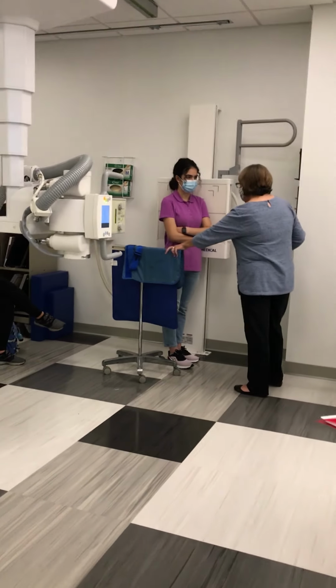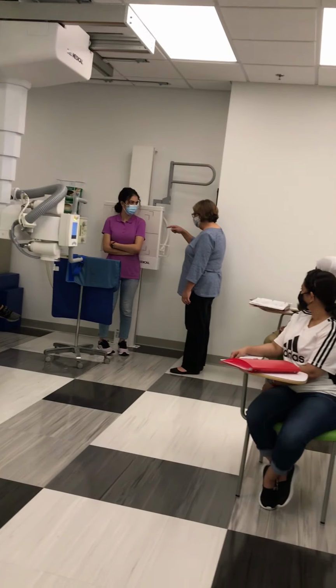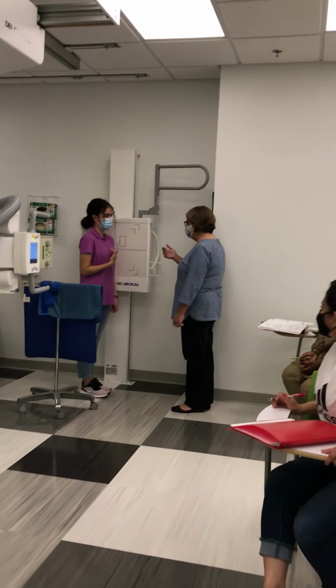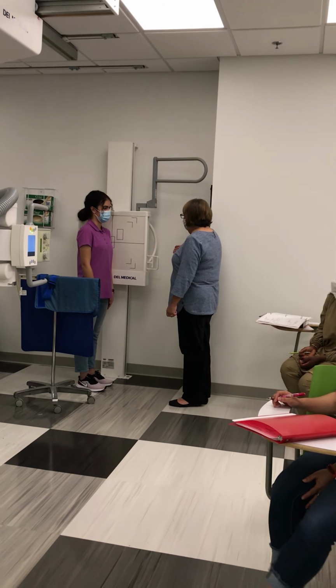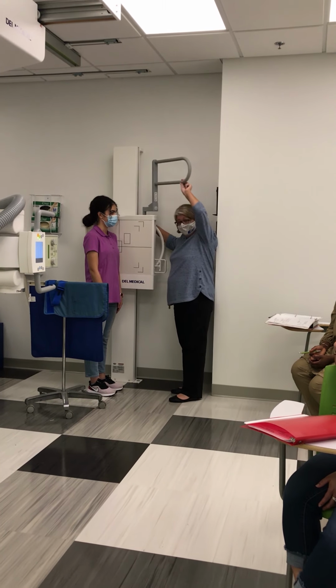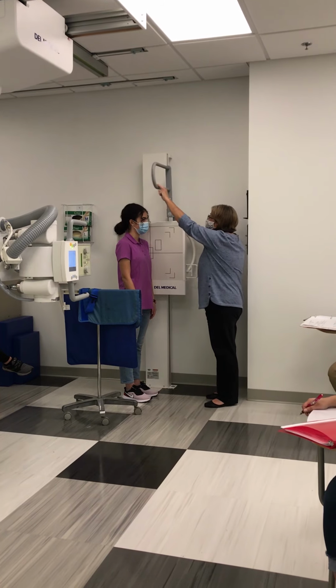Okay. For the lateral, I want you to turn and place your left side against the board. Turn and face me. Now, I'm gonna move this handle across. There's a knob back here that I pull out to release the handle.